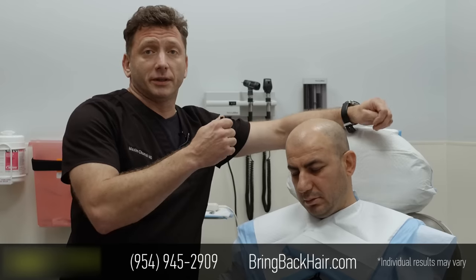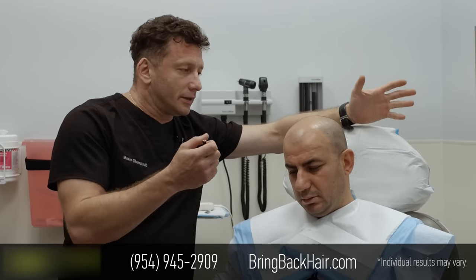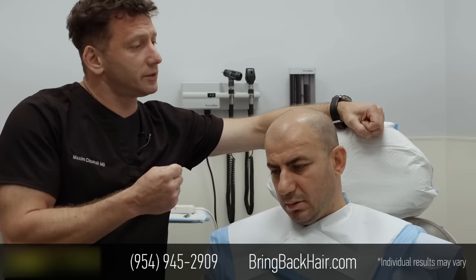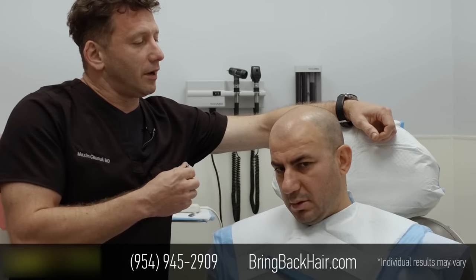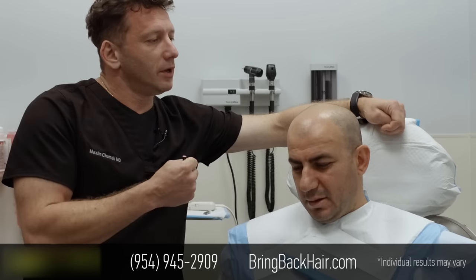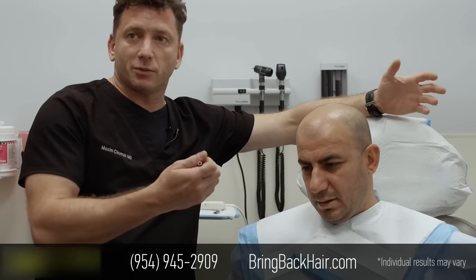We're going to begin with creating the hairline. The hairline creation is considered to be an art in hair restorative surgeries, because it has to match the individual characteristics of the face, and that's what we're doing right now.